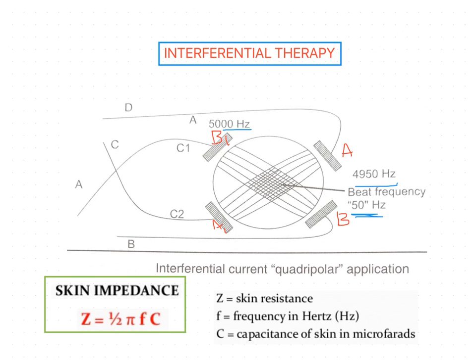The main principle involved in interferential therapy is the interference effect, where two medium frequency currents cross in the patient's tissues. So that is the principle.